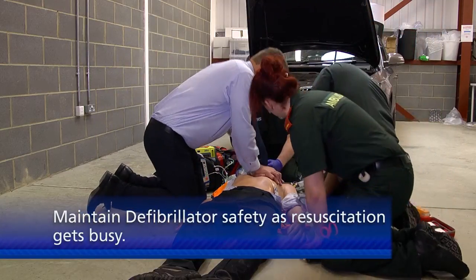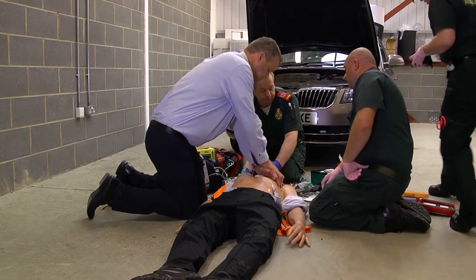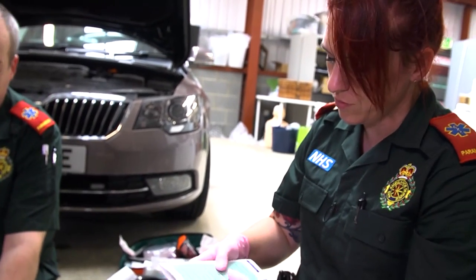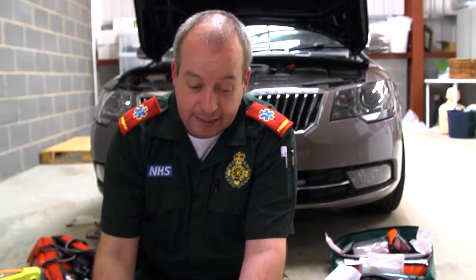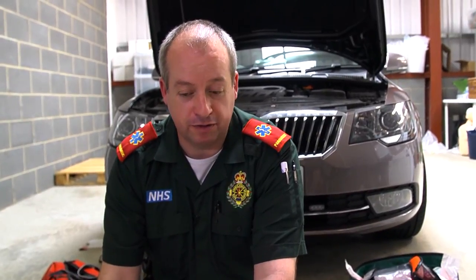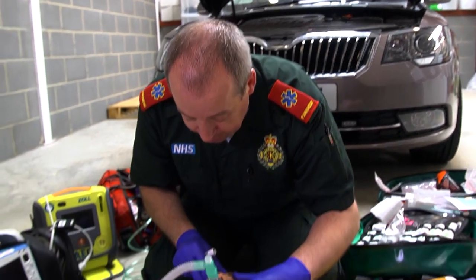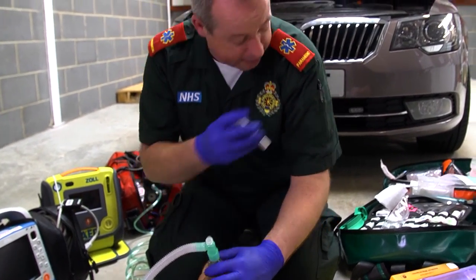Thank you. Thanks, Jamie. I've got BM 7.2. Excellent, okay. That's really good quality, Jamie. Well done. Okay, so hypoxia. We've got an i-gel in, and we've got good ventilation, it's nice and easy to bag, and we've got good end tidal. Happy with that. Toxins. Okay, there's no history to suggest any drug misuse or anything like that. There's no chemicals in here that I'm aware of. Nothing reported to suggest that. Pupils are dilated, but are actually reacting sluggishly.